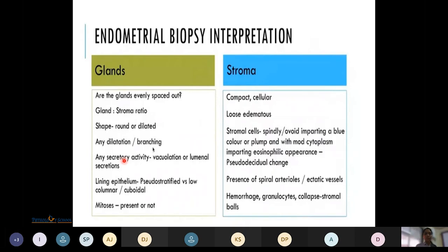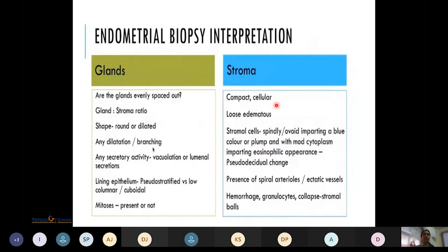For microscopic interpretation, we look at glands and stroma. For glands: whether evenly spaced, gland-to-stroma ratio, if glands are round or dilated, branching, secretory activity such as vacuolation or luminal secretions, and lining epithelium (pseudo-stratified, low cuboidal, or columnar, and presence of mitosis). For stroma: whether compact or cellular, spindly cells imparting a blue color or plump cells with moderate cytoplasm imparting eosinophilic appearance (pseudo-decidual change seen with progesterone effect in secretory endometrium). Also noted are spiral arterioles, ectatic vessels, hemorrhage, granulocytes, and collapsed stromal balls.